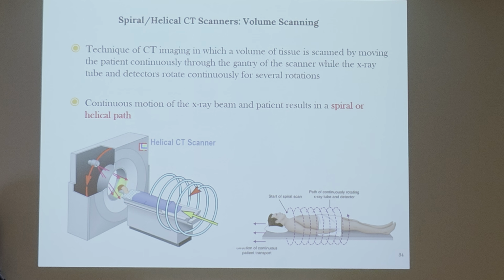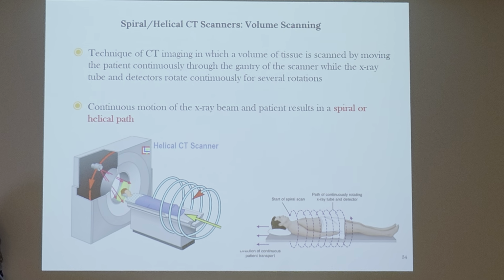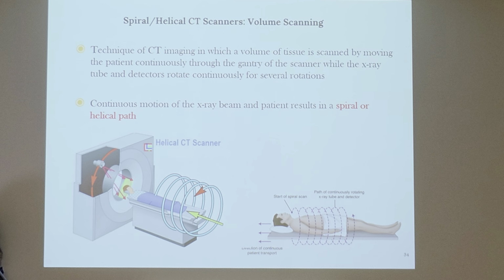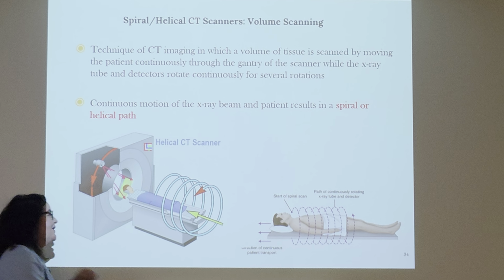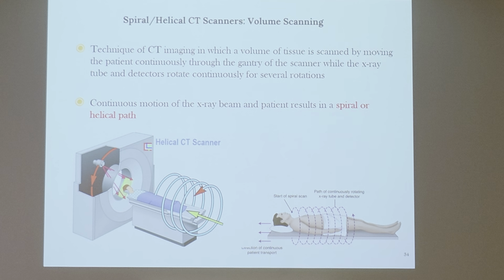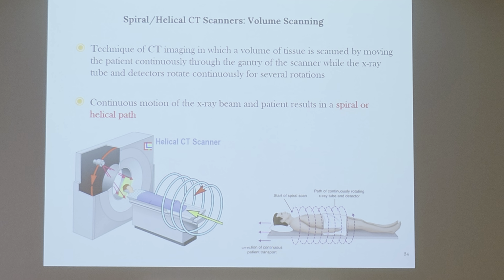We talked about the detectors moving around, right? And we found that in which generation? Samantha was like, no, it's not the first. The first did what? Side to side, called what? Translate, then rotate, and then translate back, right? What was the word here that really threw you, that would really be able to say, oh, this could not be the first generation?